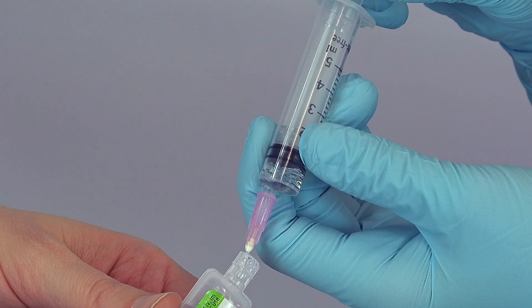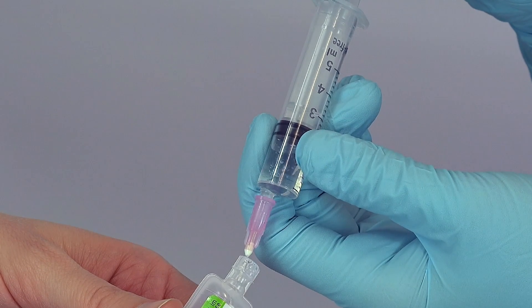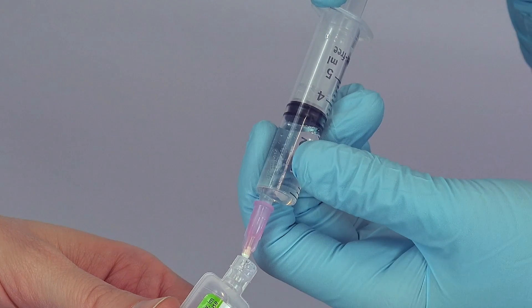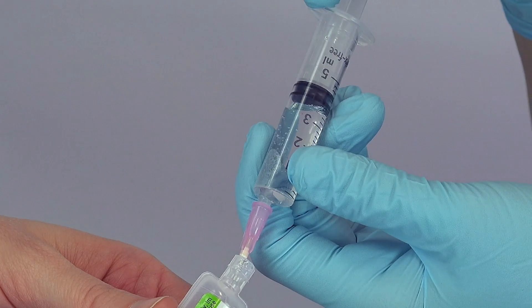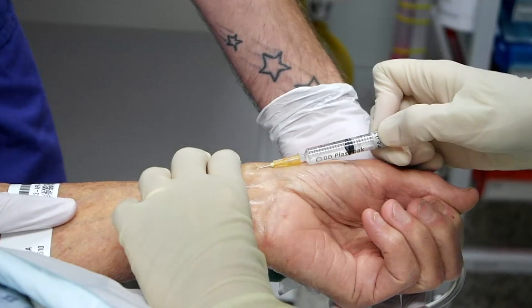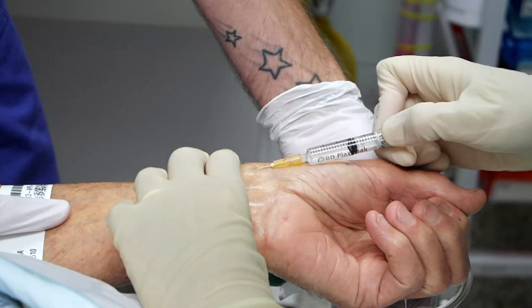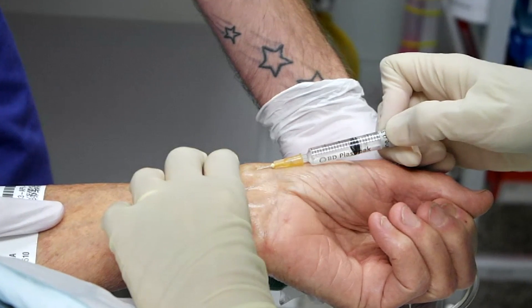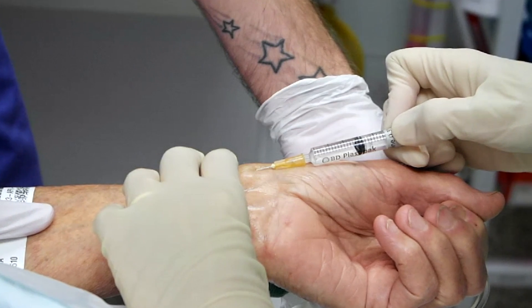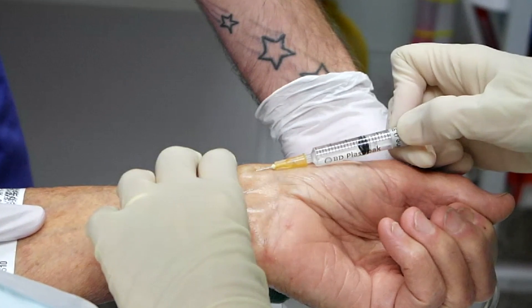Some individuals prefer to inject local anaesthetic at the site where the ABG sample is going to be taken. However, if performed well, the procedure should be completed in a single puncture. So the additional puncturing of the skin and the discomfort from injecting the local anaesthetic itself essentially nullifies any benefit from using local anaesthetic in the first place, so in our case we won't be using it.